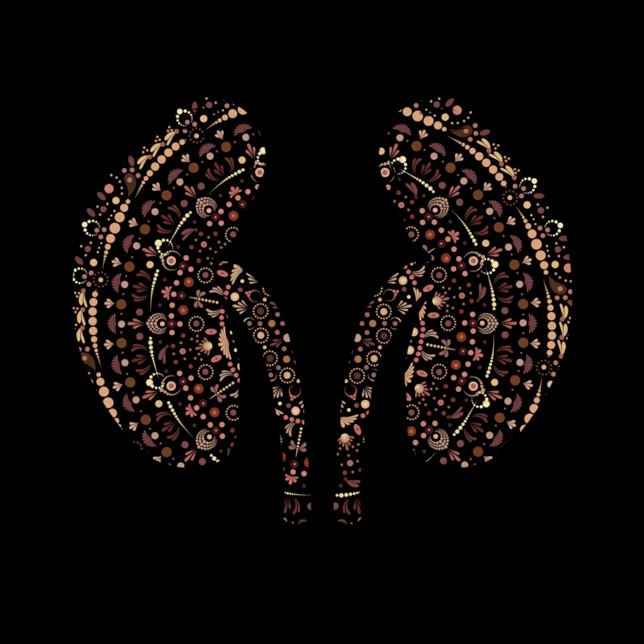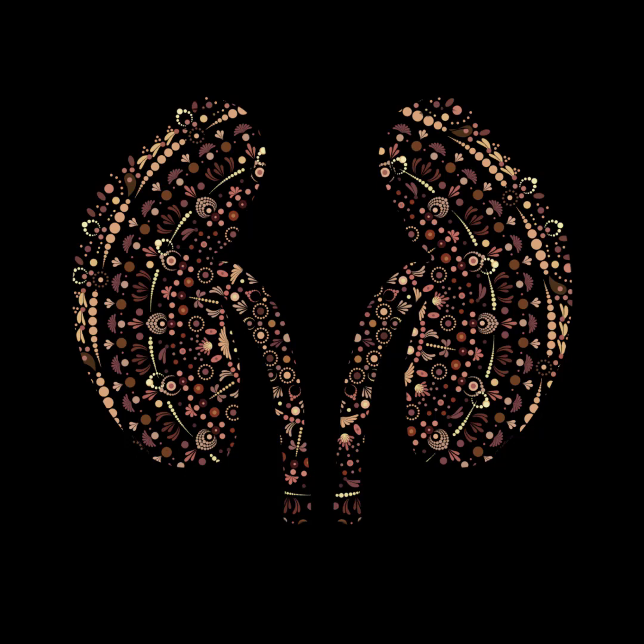The bladder is easily visible as the fluid-filled structure in the pelvis. Ultrasound can be used to estimate pre and post void volumes of urine, stone formation, and the presence of ureteral jets. The normal ureters are not visualized but can be seen lateral to the bladder if they're dilated.